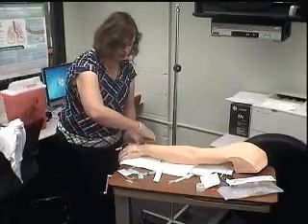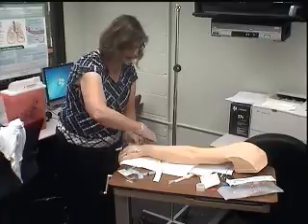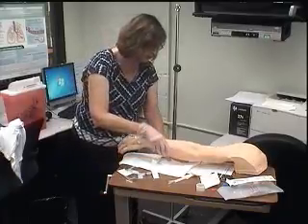Okay. Now I need to date, time, initial it, and write that on either a piece of tape or a sticker. Sometimes they have little stickers that you can stick on and label that. Okay?